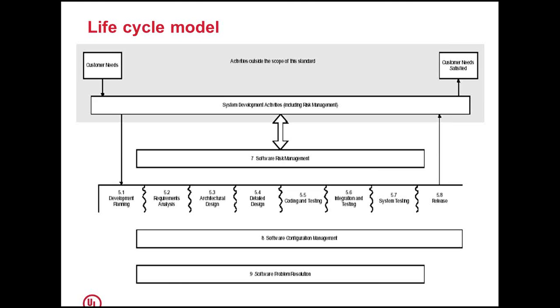Development planning, requirement analysis, architectural design, detailed design, coding, testing, integration testing, system testing, release. After the release, there is software problem resolution, that is your bug fix and management. And of course, throughout the process, there is configuration control, given as configuration management there. Finally, once the software is released, it goes back to the customer with the customer needs satisfied.